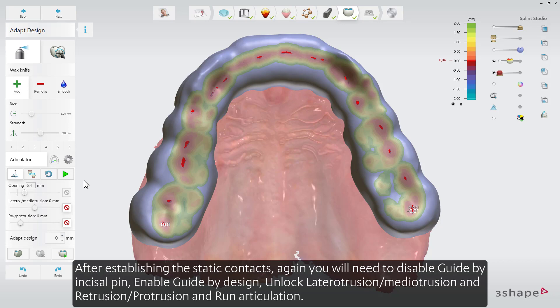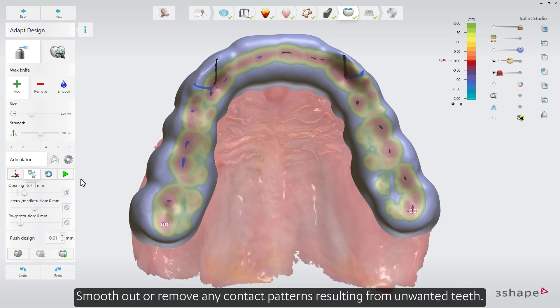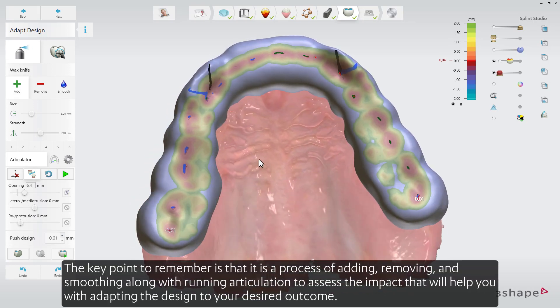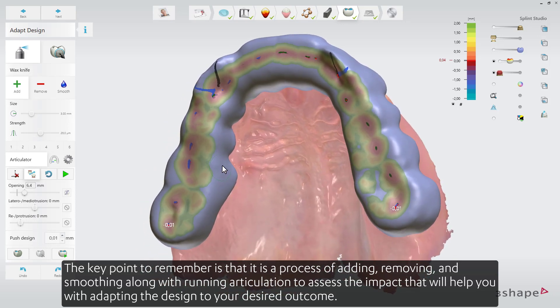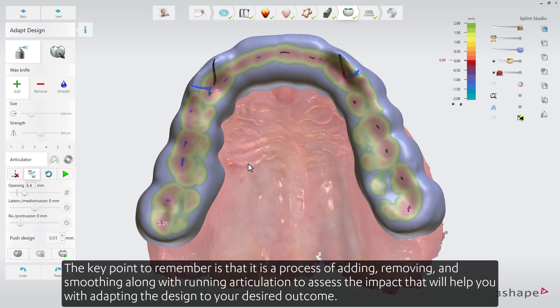After establishing the static contacts, again you'll need to disable guide by incisal pin, enable guide by design, unlock laterotrusion and mediotrusion and retrusion and protrusion, and run articulation. You can add or remove material to strengthen or weaken the contact pattern induced by each antagonizing tooth. Smooth out or remove any contact patterns resulting from unwanted teeth. The key point is that it is a process of adding, removing, and smoothing along with running articulation to assess the impact — this will help you adapt the design to your desired outcome.